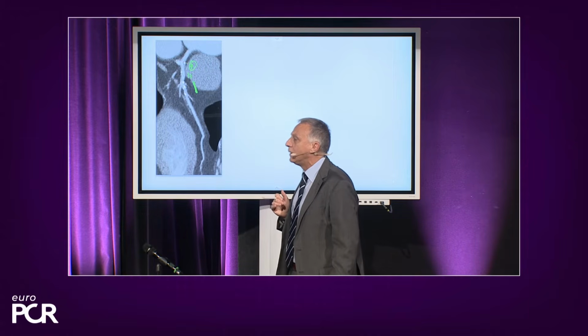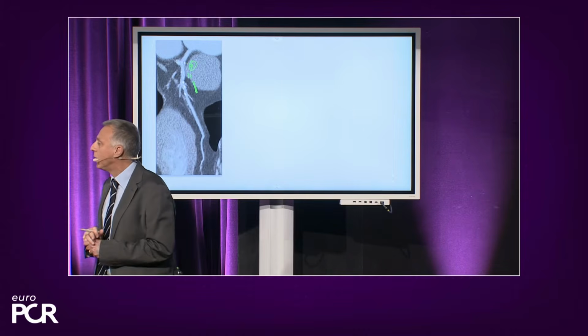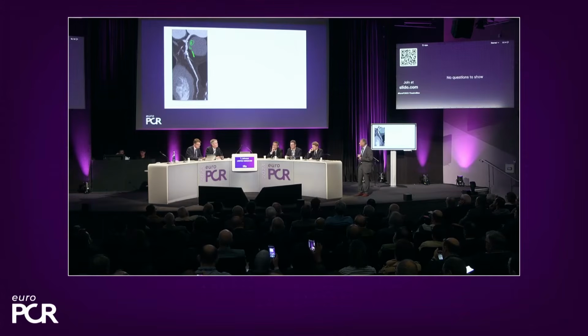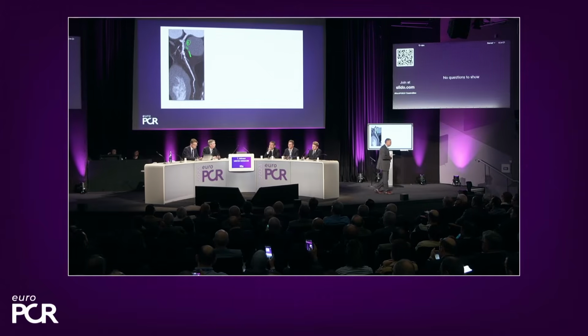So, what is the reaction when you go back to plan your procedure according to these images taken at CT scan? Yeah, thank you, Francesco. I'll go to Maciej because there is also clinical risk. This is a 75-year-old patient. There is increased bleeding risk, plus use of non-invasive imaging. If you put everything in context, what are your general concerns?